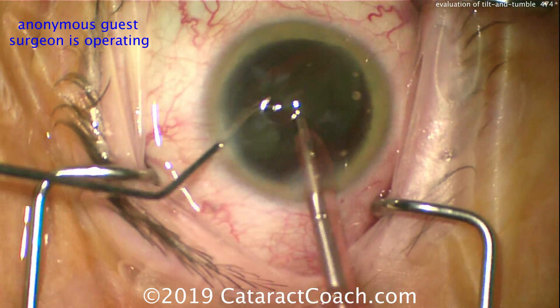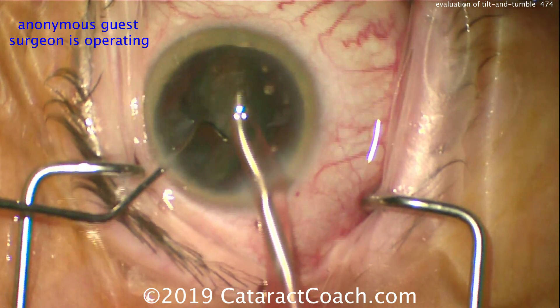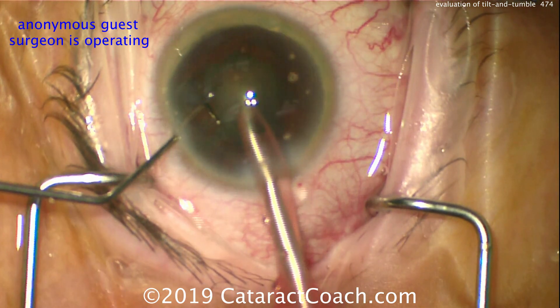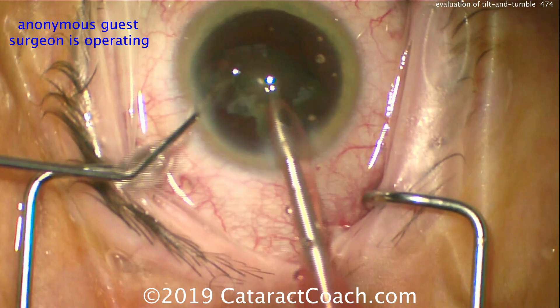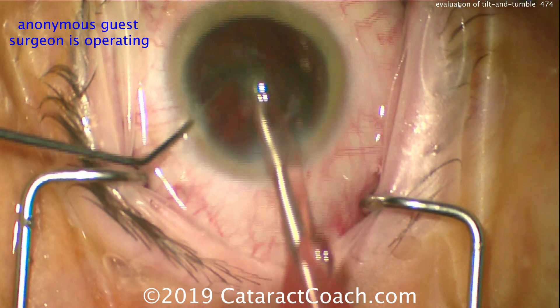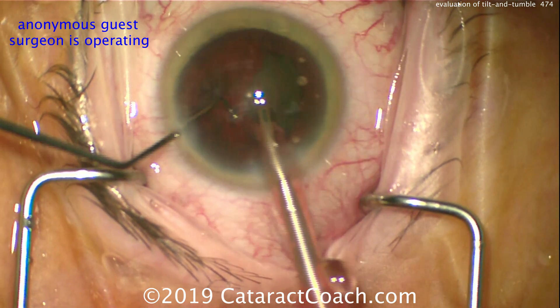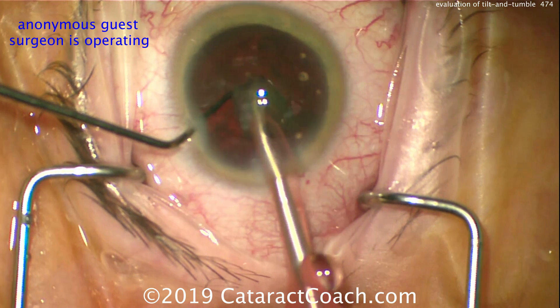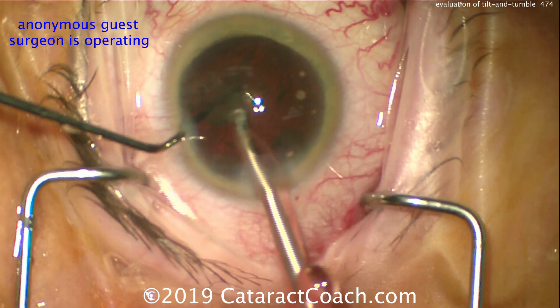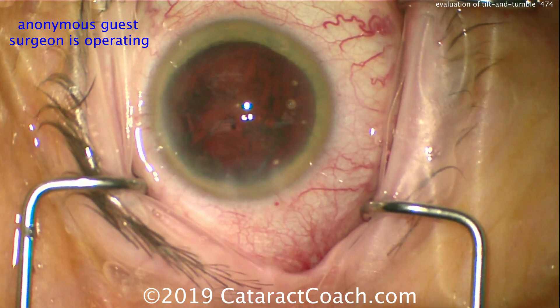Here comes the last of the nucleus — it's coming out okay. In this case, you may end up with some corneal edema: prolonged FACO time, operating a little too close to the corneal endothelium, and putting more fluid as well as FACO energy in the eye than probably needed. Good job so far — you're making good progress. But try our suggestions and take those to heart. If you're going to do FACO tilt and tumble, remember we reserve this for softer lens nuclei — two-plus nuclear sclerosis or less is ideal for this technique.